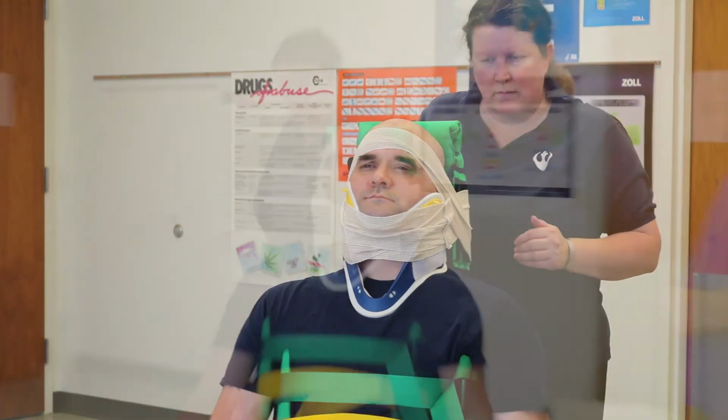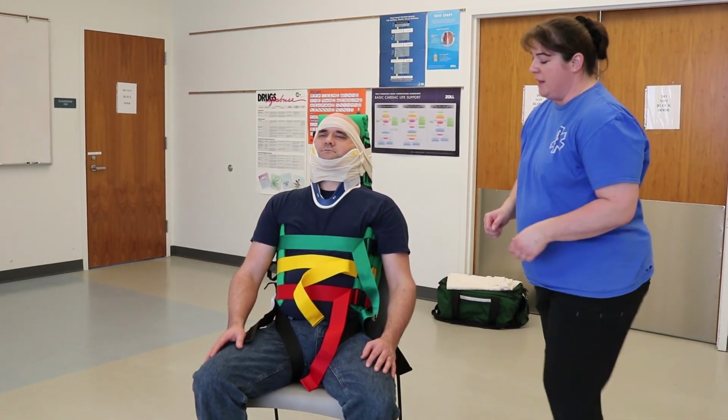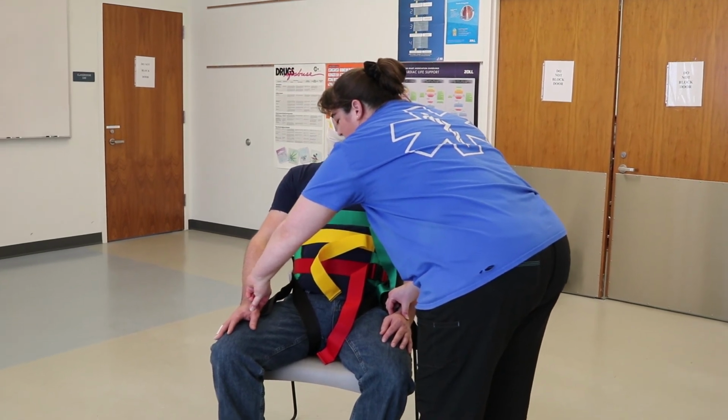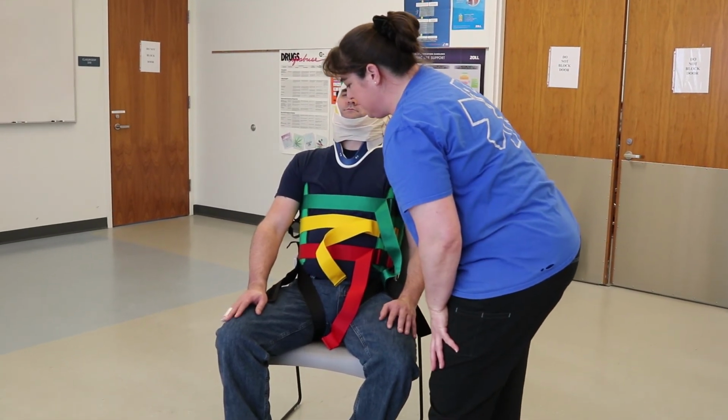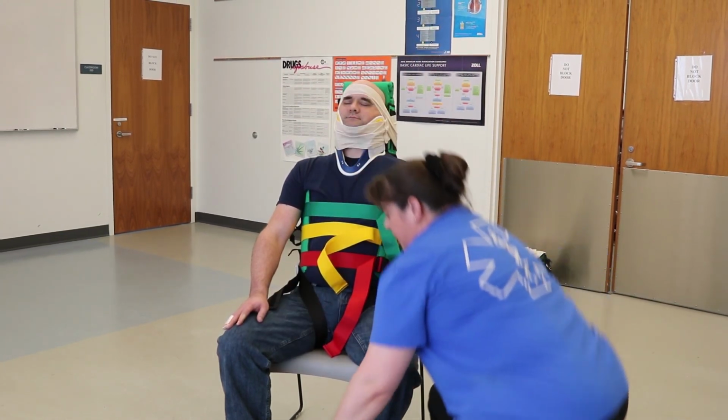Okay, C-spine can now let go. I'm going to place my patient onto a longboard, and then I'm going to recheck pulse, present and normal. Can you wiggle your fingers, movement, and sensation? What finger am I touching? Index. And I'll also check the pedal pulses.